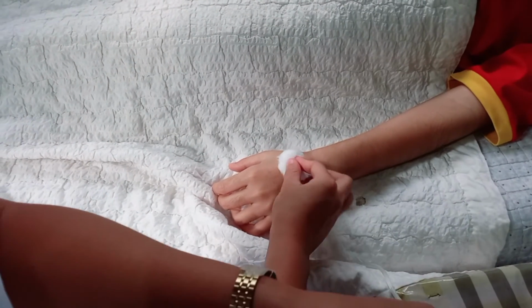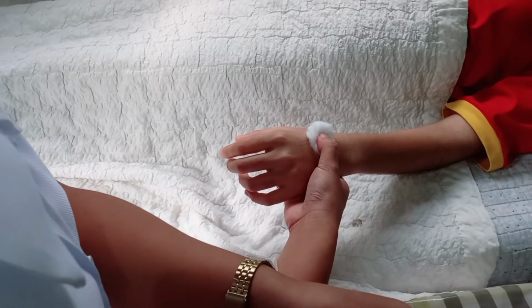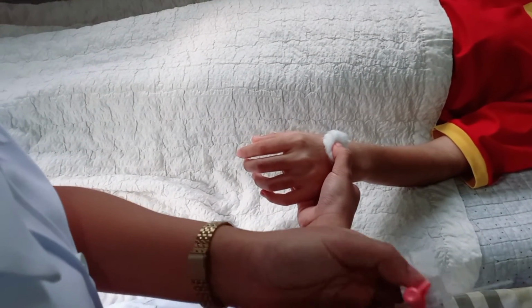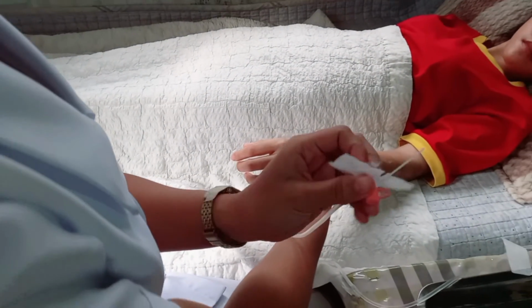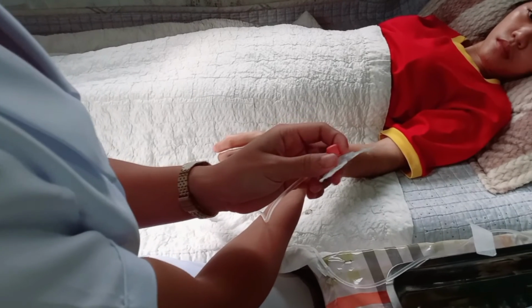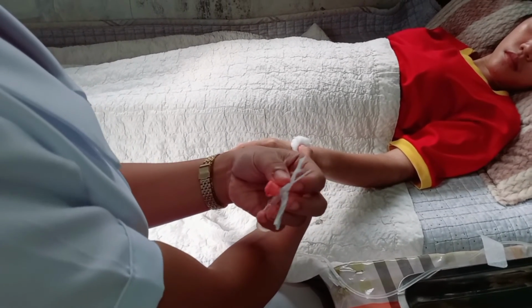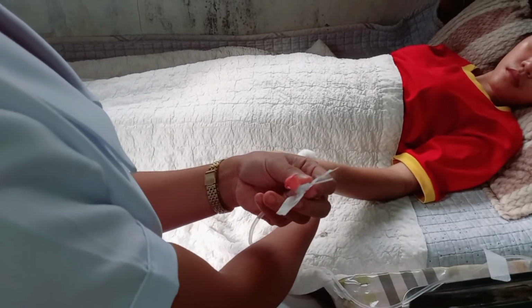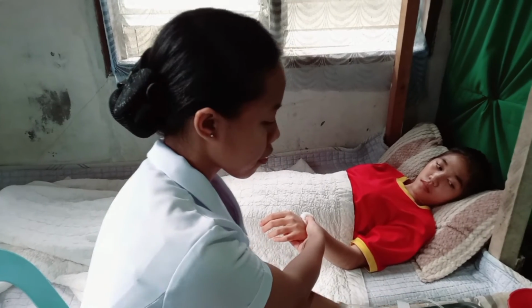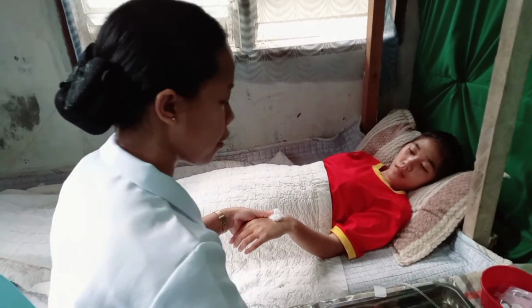After removing, we will hold the patient's hand and apply pressure to it for about 2 to 3 minutes until the bleeding stops. While holding, we will check the needle or the cannula to make sure that it is intact, and if a broken needle is observed, we will immediately report it to the nurse in charge. After that, we will now apply a cotton ball or a band-aid.